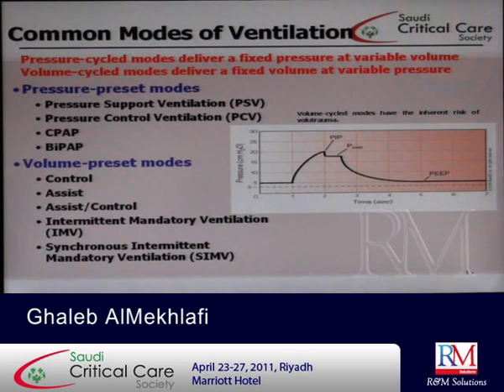So in control only, the patient is totally controlled, that is not doing any effort. In support, in BiPAP and CPAP, the patient is the one who is driving the machine and we are just supporting. In the volume modes, it's either control, assist control, or intermittent mandatory ventilation. Again, it's the same, mandatory means control. Or synchronized intermittent mandatory ventilation. Now in intermittent mandatory ventilation, we are delivering a certain number of controlled breaths, and in between the patient is taking totally spontaneous breaths.